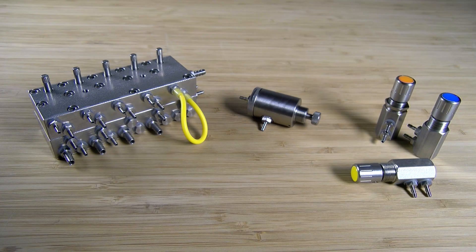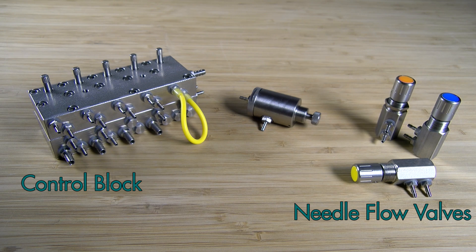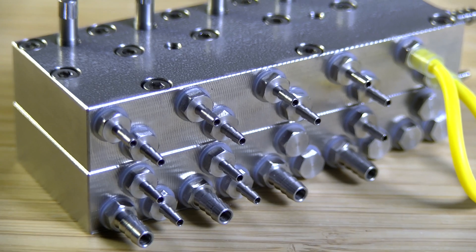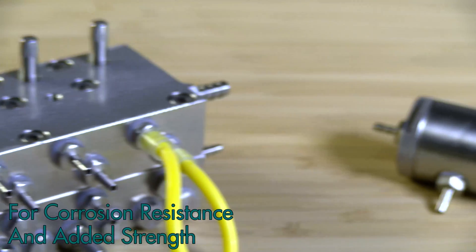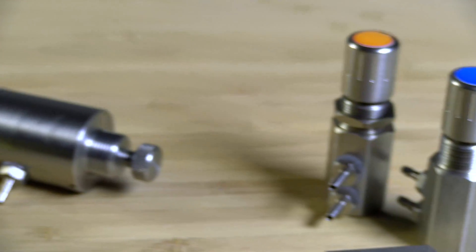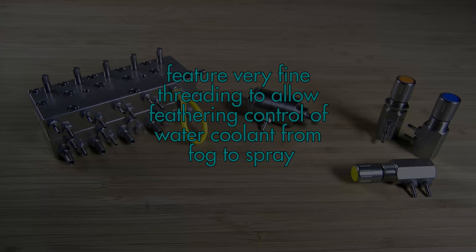The internal dental unit components including the control block, needle flow control valves, and water relay valve are constructed from stainless steel for corrosion resistance and added strength. The stainless flow valves for water spray feature very fine threading to allow feathering control of water coolant from fog to spray.